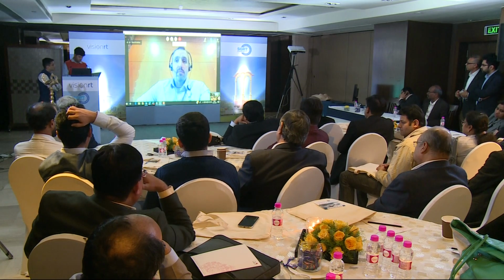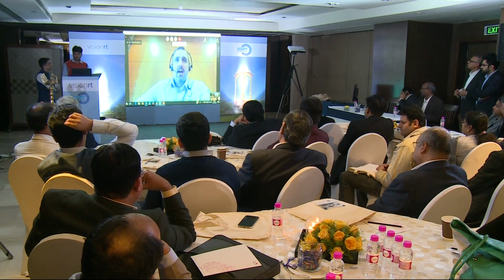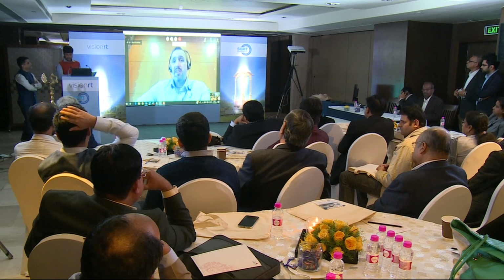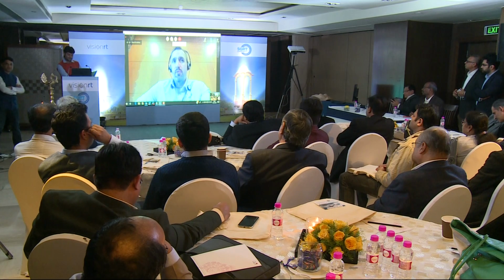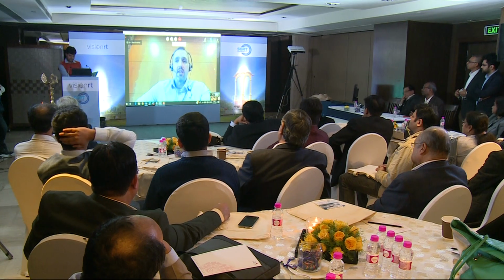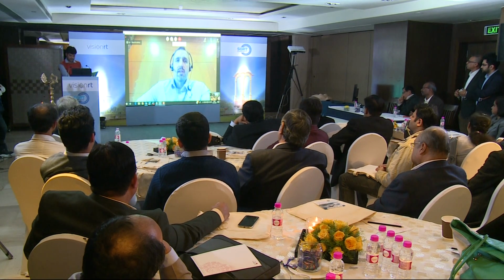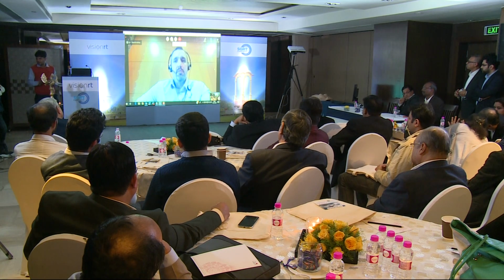Some people really like the BodyFix system, which has the cellophane and the Vac-Lok bag and all of that. I think that's a challenge for SGRT because you're covering essentially the entire surface of the patient in a non-reproducible way sometimes from day to day. And there are other immobilization systems, like the Civco systems that have the gates that go across the patient for abdominal compression and all that, where you're obstructing the surface. Those are really non-complementing immobilization systems.